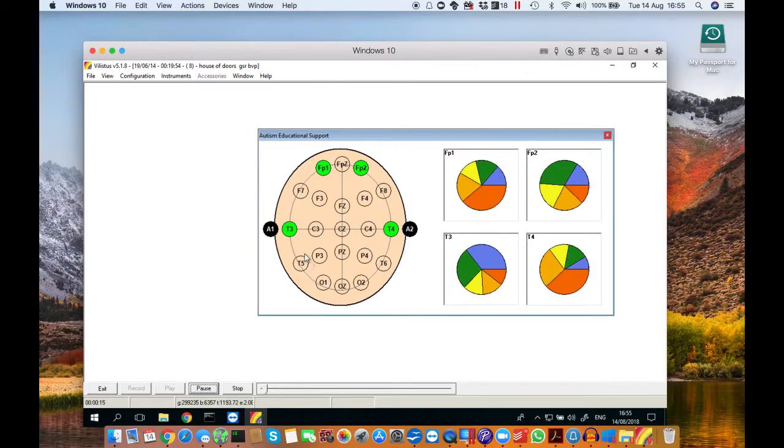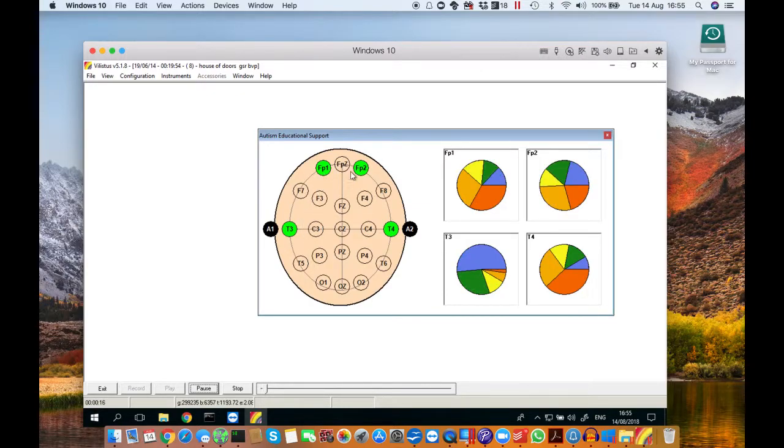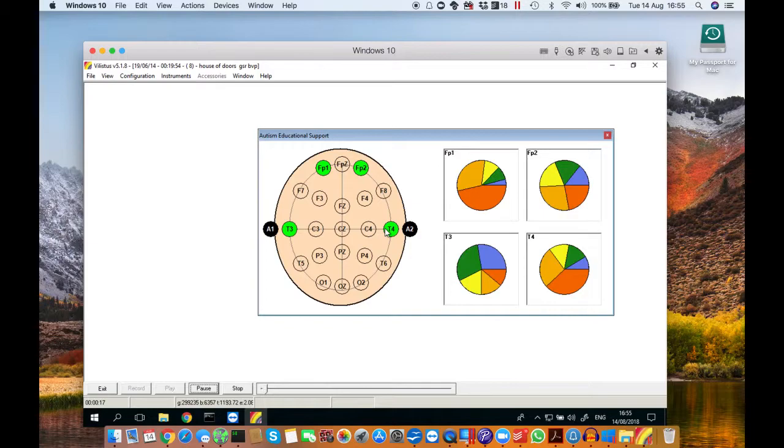On the left-hand side you'll see a big circle with a lot of other little circles inside. The colored circles represent where the electrodes are placed on your head. They change color independent of each other depending on the signal that you're getting, so it's easily identifiable where the bad connection is coming from.